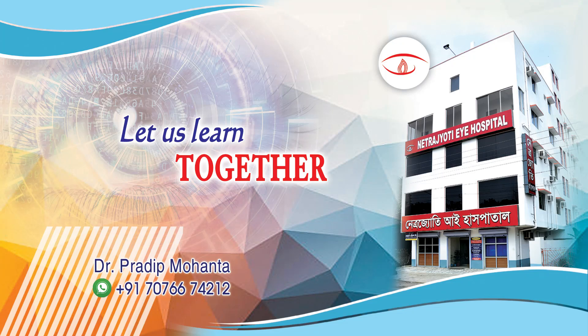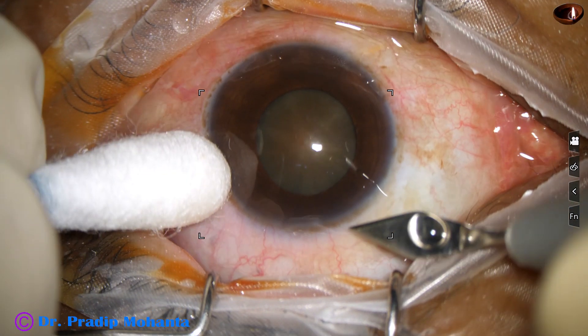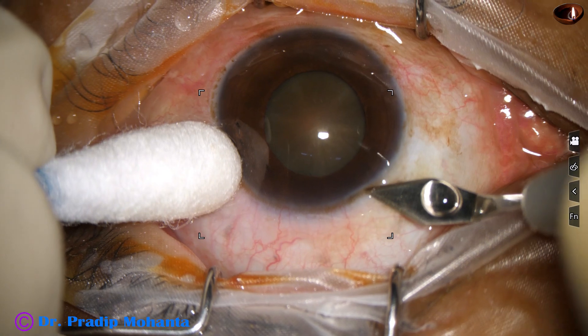Friends, welcome to my workplace for hands-on PHACO and SICS training. This is a hard cataract with not so well dilated pupil. Let us observe this surgery.